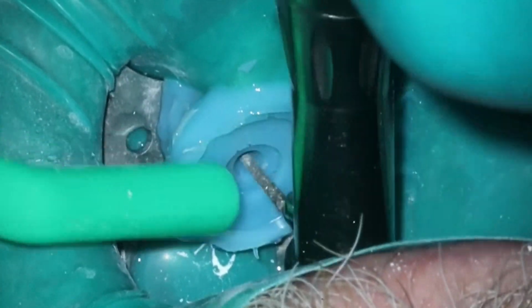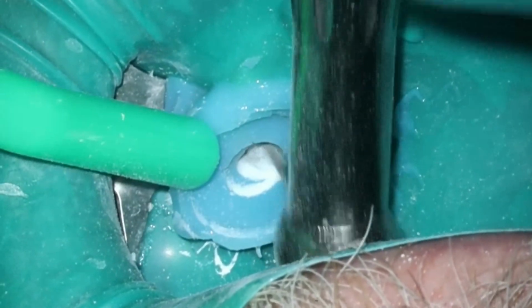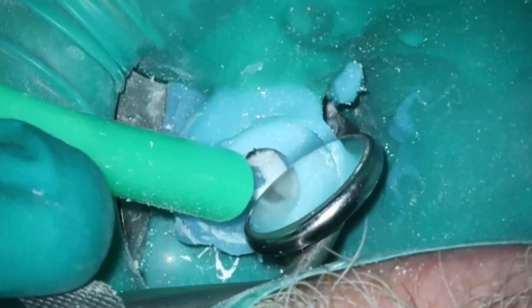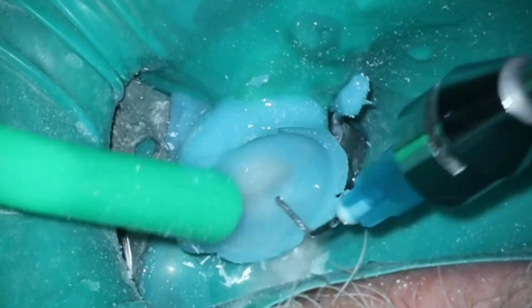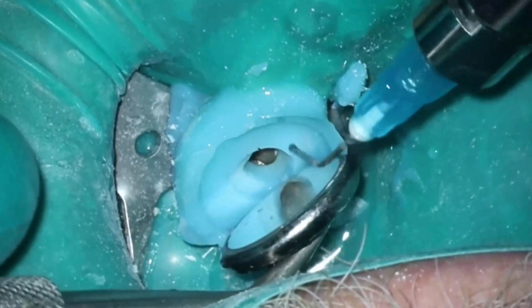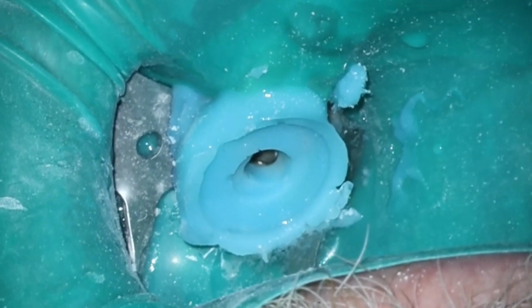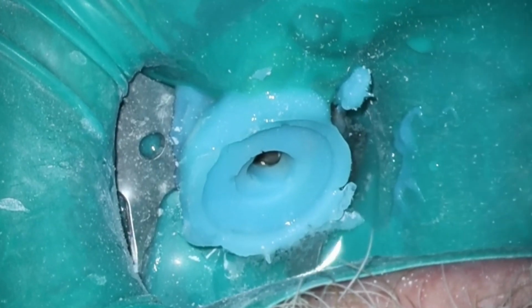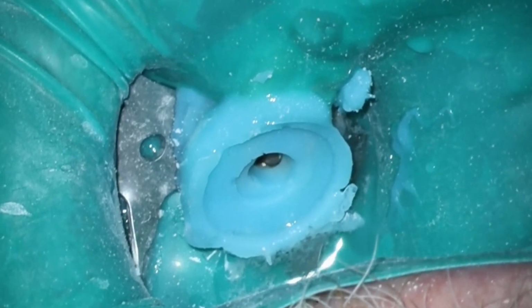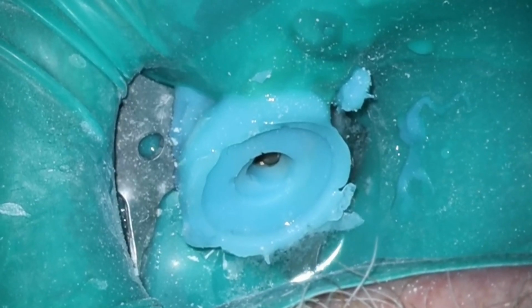I've sped it up a ton, so you don't have to sit through that whole thing. And I think I mentioned this in the previous video, I have found that it is good, this is a technique from the old 3-piece molar style GentleWave, to go back and re-access. I've found that I'm starting to do it on all my cases. It does seem to make a big difference with the seal and getting everything working better. Just go back in and re-access, get any of those undercuts out of the way, and it tends to work a little bit better with the machine itself.